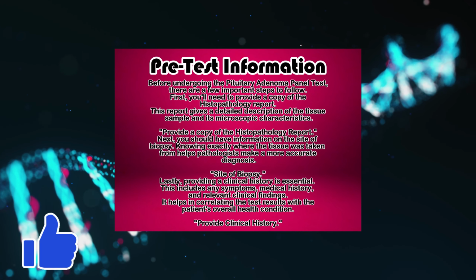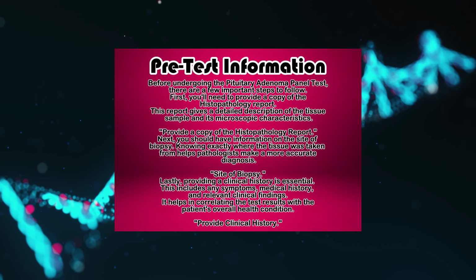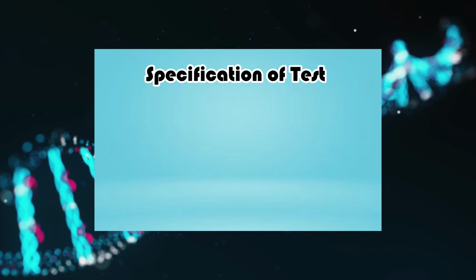This includes any symptoms, medical history, and relevant clinical findings. It helps in correlating the test results with the patient's overall health condition. Specification of the test.